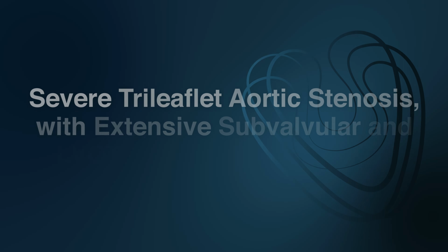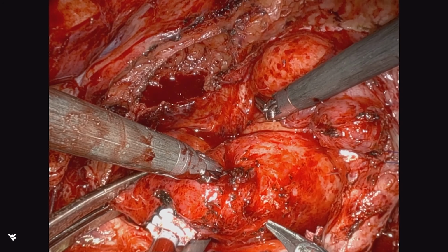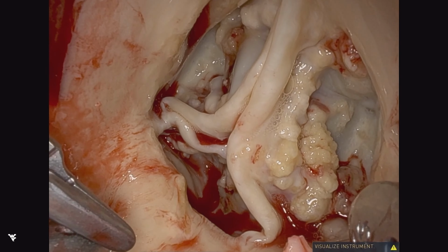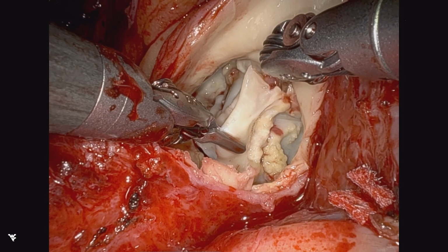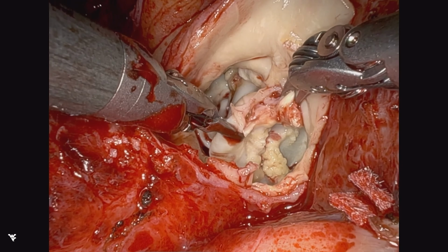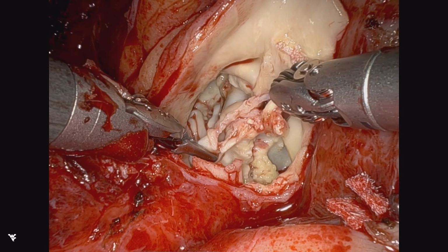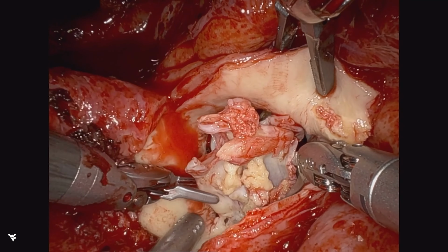Now here's a case that's even more extensive, and this is a patient who likely had some radiation in the past, who was in his 70s, who had severely calcified trileaflet aortic stenosis. And this is where we have to be very precise because there is multi-level stenosis, as you can see, in encroachment not only LVOT, but also on the anterior leaflet of the mitral valve.